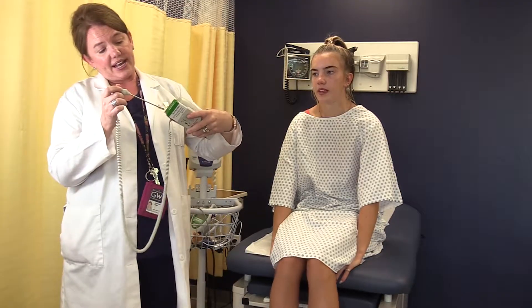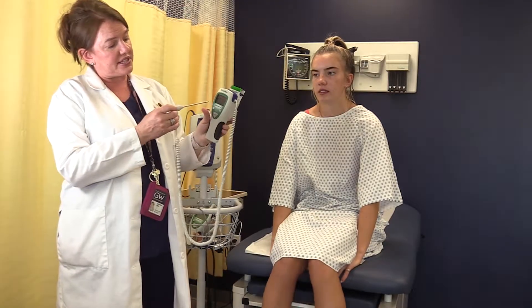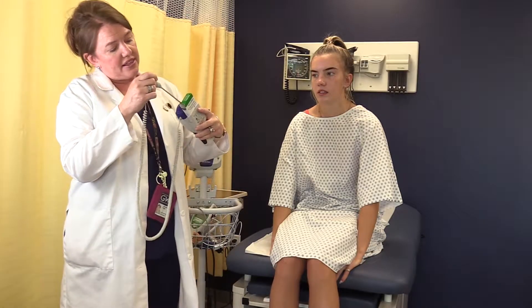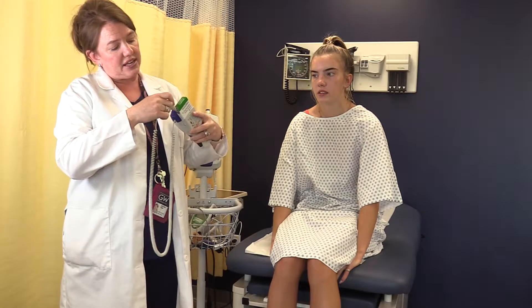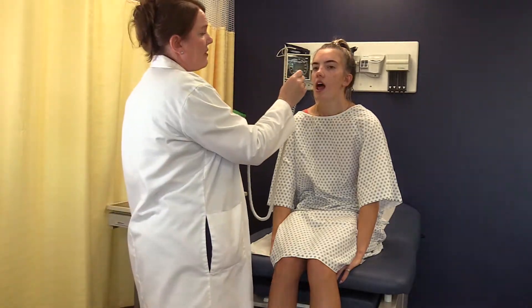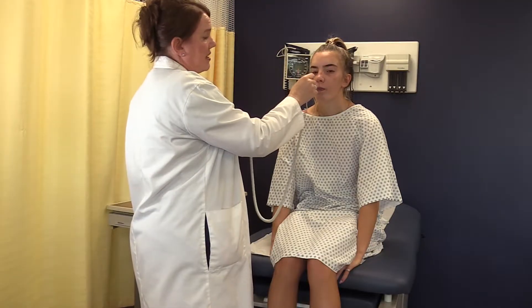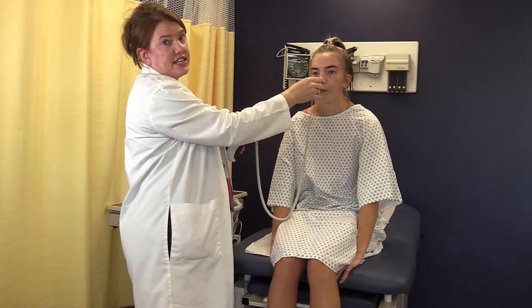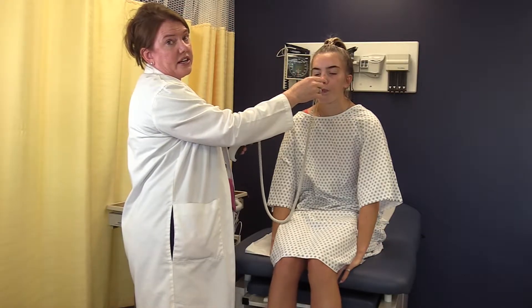Go ahead and pull this up, and you'll see it come on — it says oral, getting ready. Then you're going to sheath the probe, and have the patient open up their mouth. You're going to slide it under their tongue toward the back and have them close their lips, so you get a good seal and an accurate oral reading.